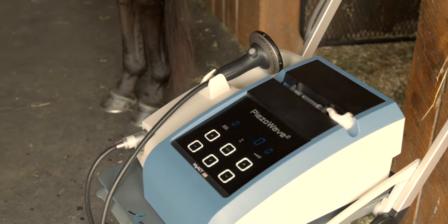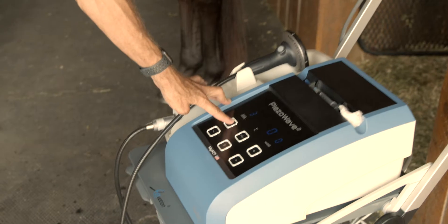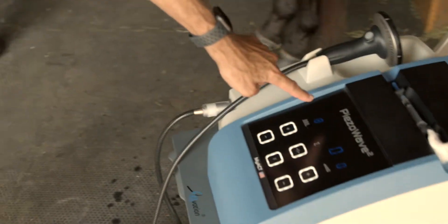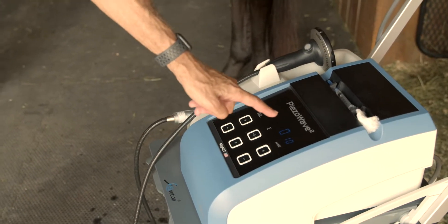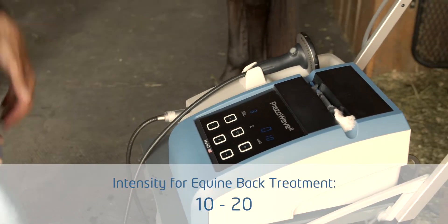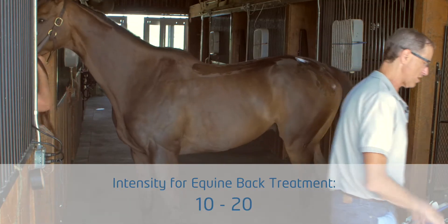Simple operation. This button here indicates how many shocks per second — it's a maximum of eight. And this one is the intensity of the shock, so it goes from zero to 20. Typically I start with 10 and go up or down from there.